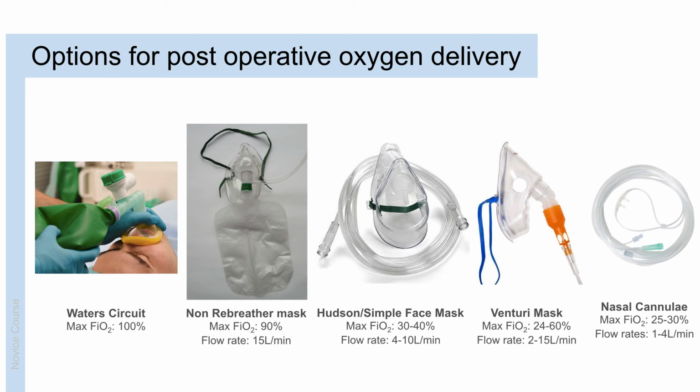Venturi devices can deliver a wide range of inspired pressures of oxygen, but are not used so commonly in recovery. And on the far right is the nasal cannulae, which can deliver a max FiO2 of around 30%. But it is worth noting that prolonged use can cause quite severe drying of the nasal spaces.